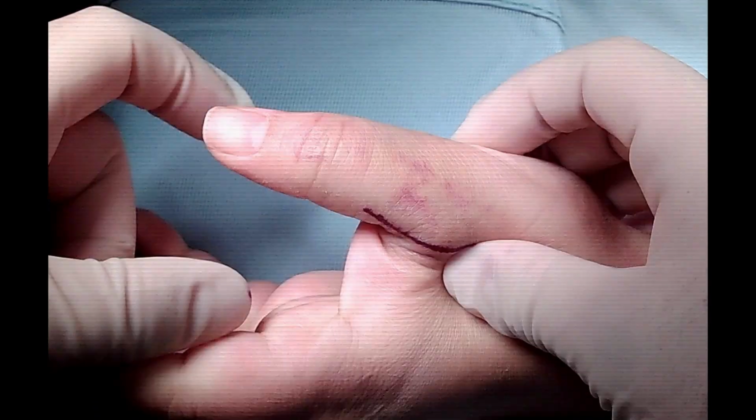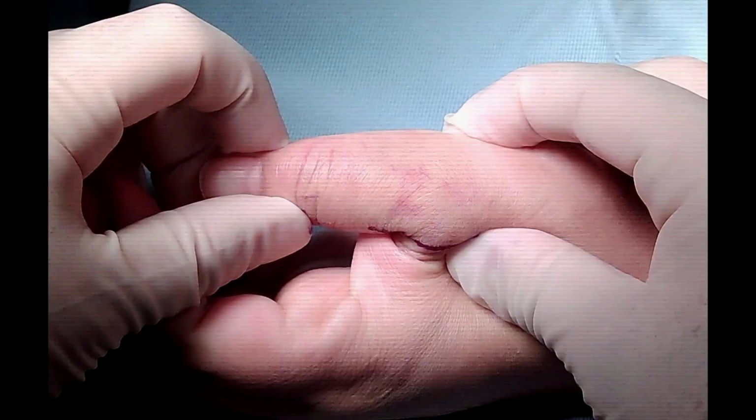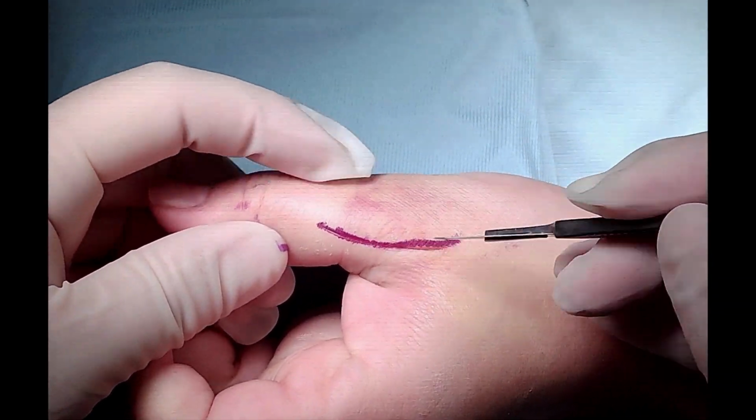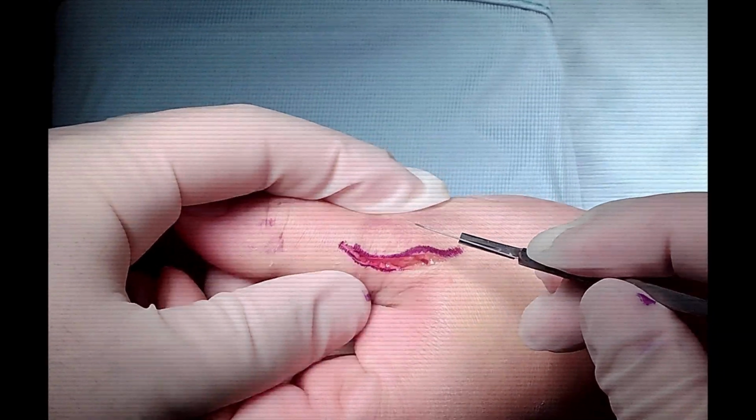So this is the ulnar collateral ligament. This is a 50 year old patient. As we see clinically, the joint opens when we put a stress upon the ligament.